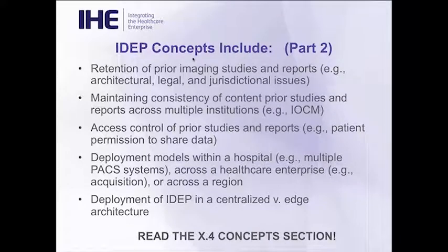Other concepts that we discuss in IDEP are the retention of prior studies and reports from an architectural, legal, and jurisdictional point of view, and the fact that it will be different in different countries and even in different states in the United States. We discuss maintaining consistency of content.